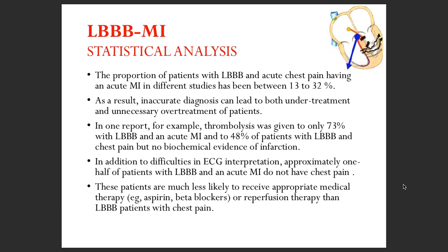Are you aware of something called MINOCA? Minoca. Something, myocardial infarction, with new onset, normal... You're almost there. Cardiac, almost there. MINOCA stands for myocardial infarction in non-obstructive coronary arteries.